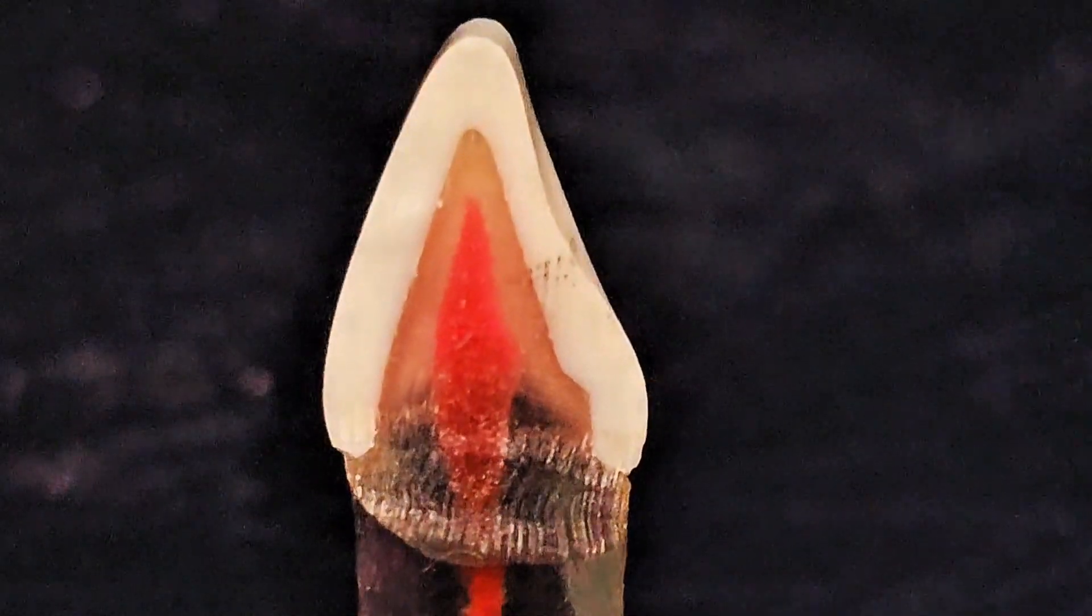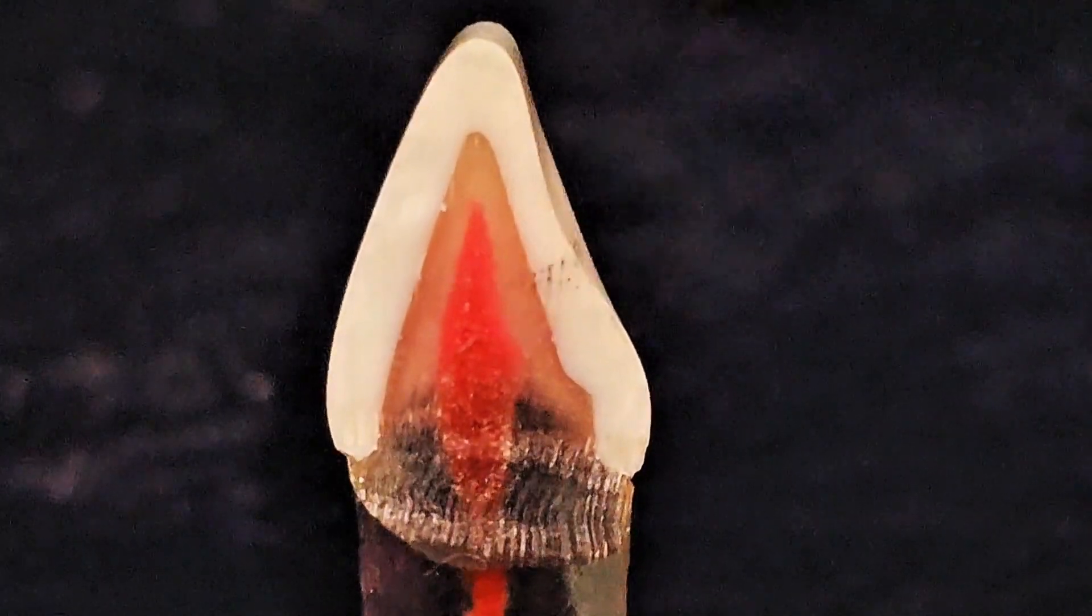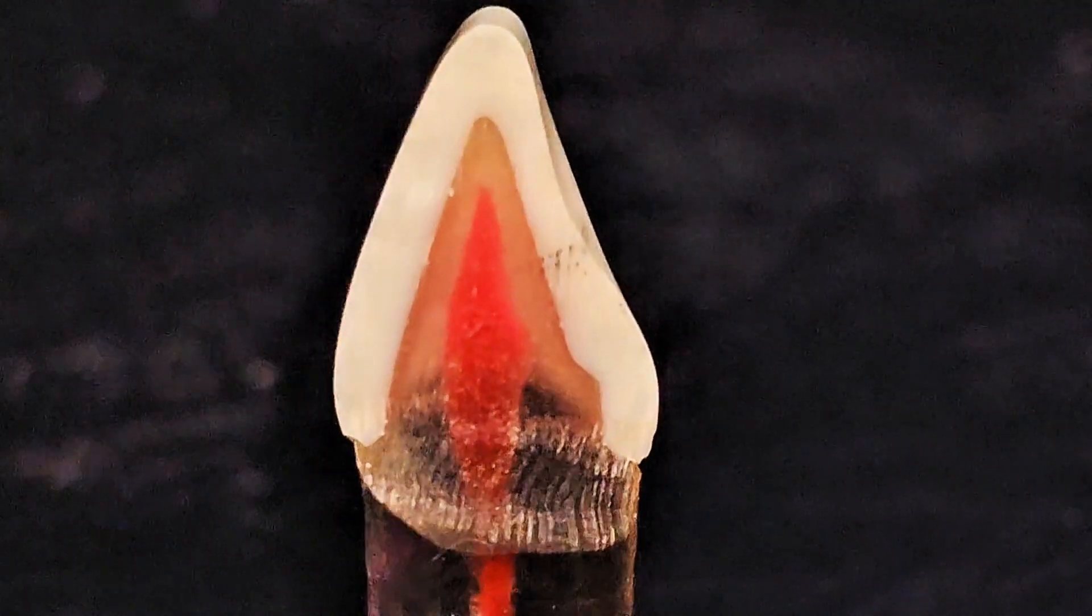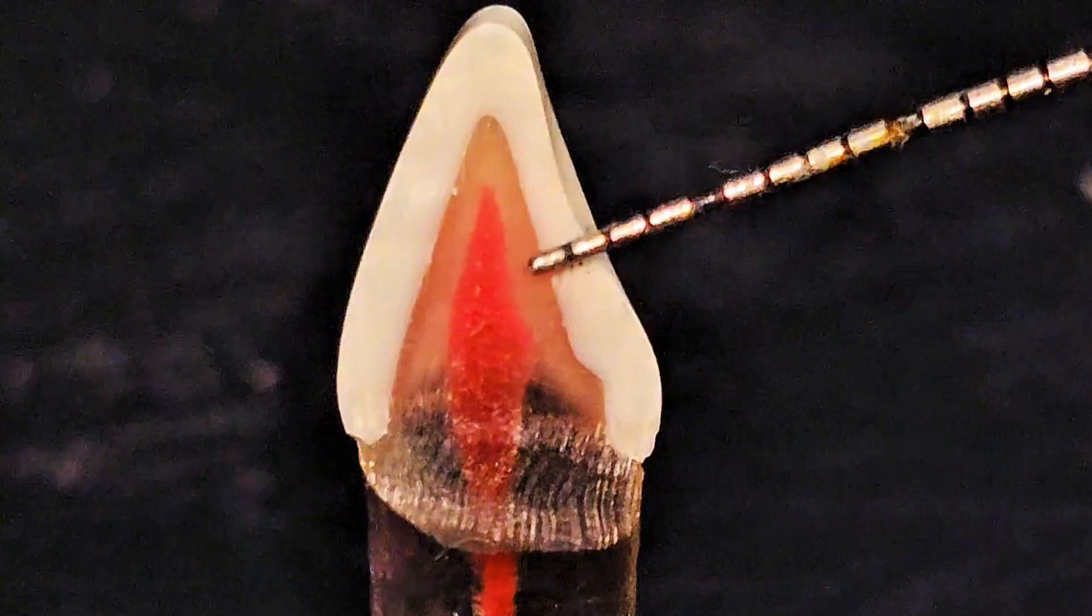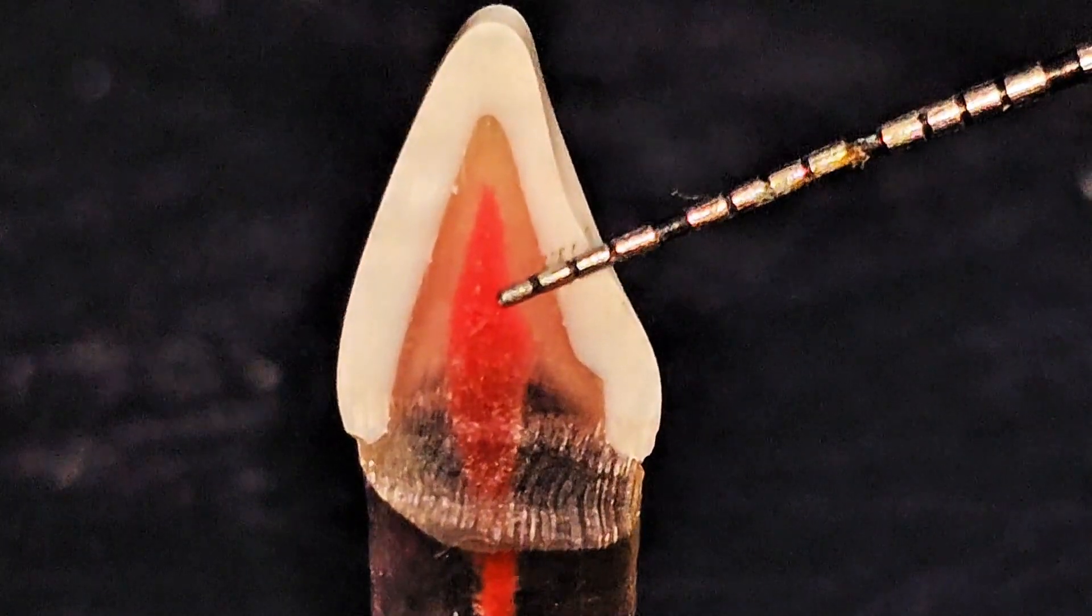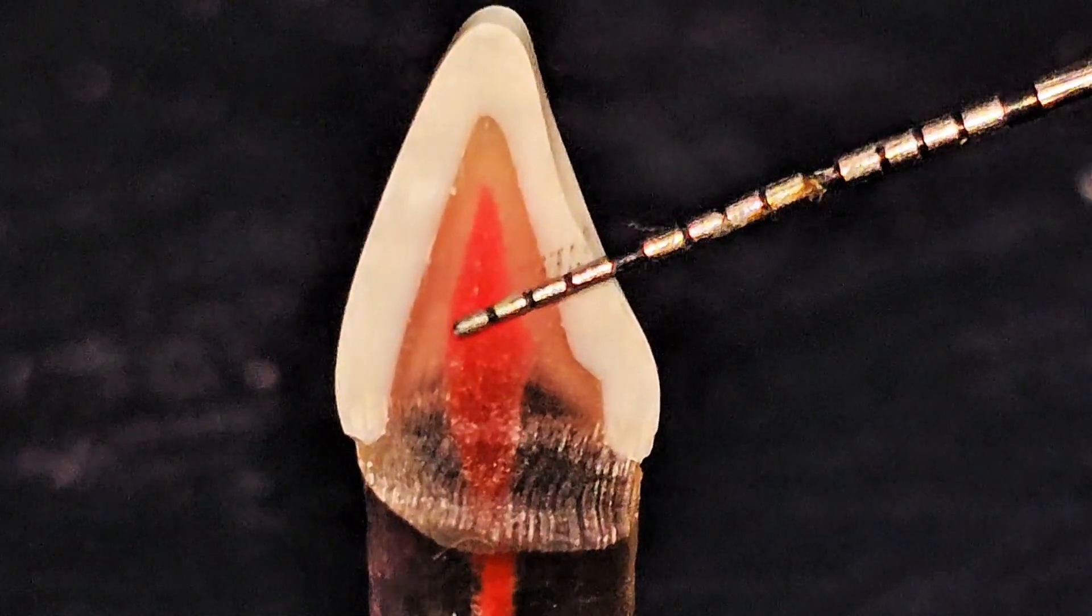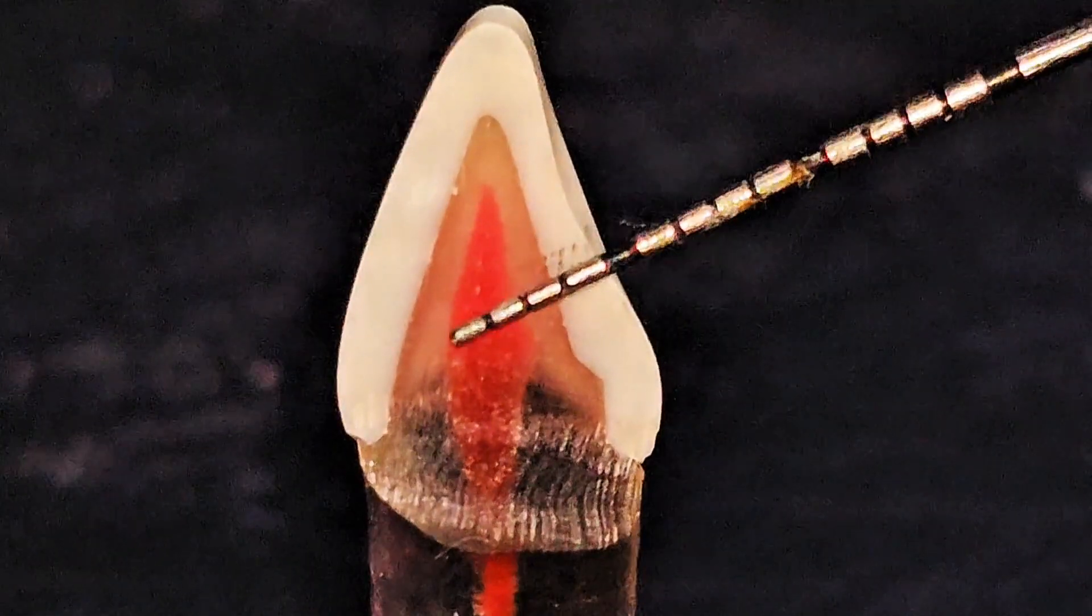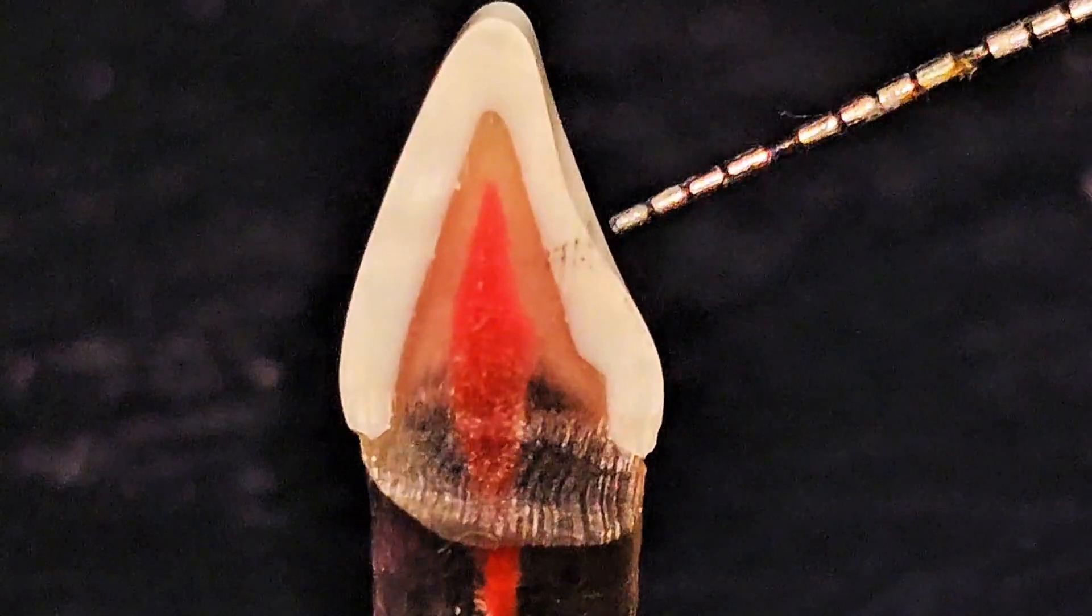This blue taped diamond is 3mm in length. So let's see the actual depth length with the probe. So with the probe it is about 2.5mm and up to the labial wall it is about 4mm if you approach from this angle from here.